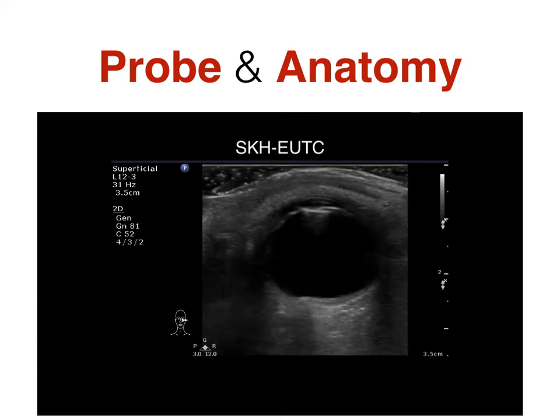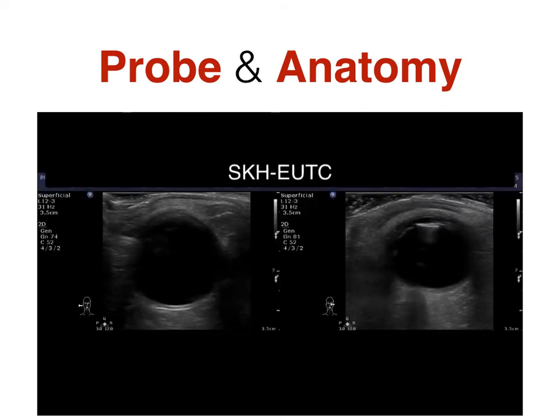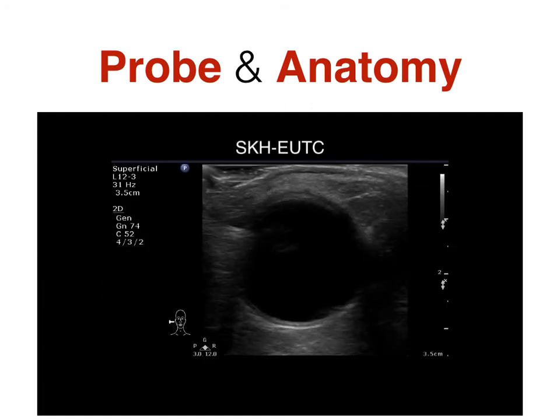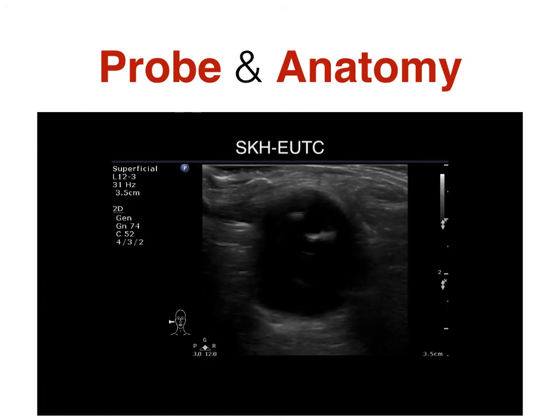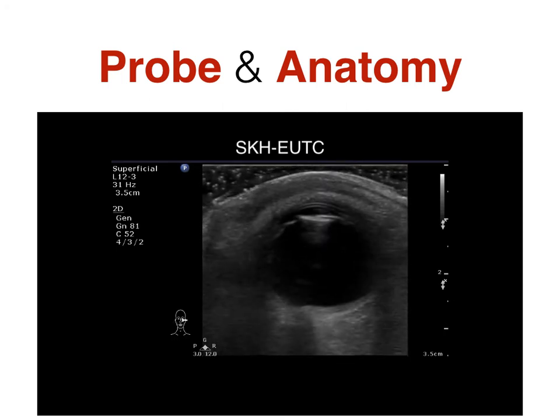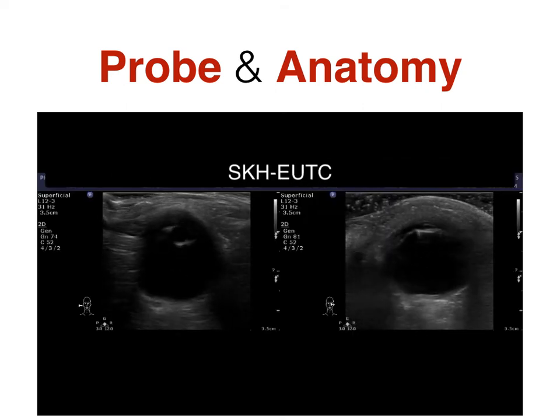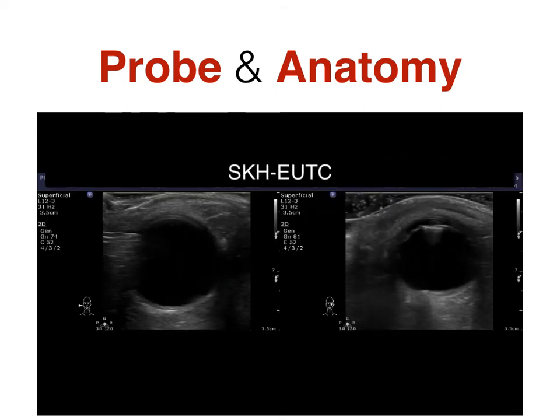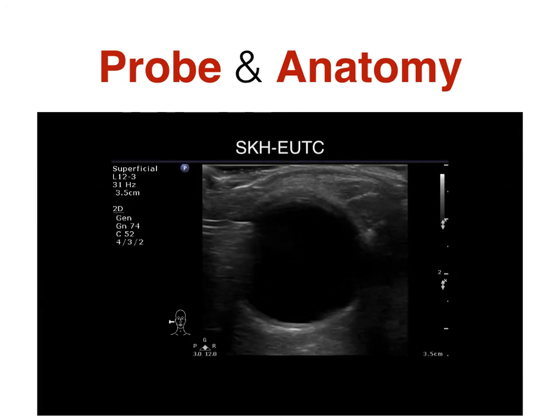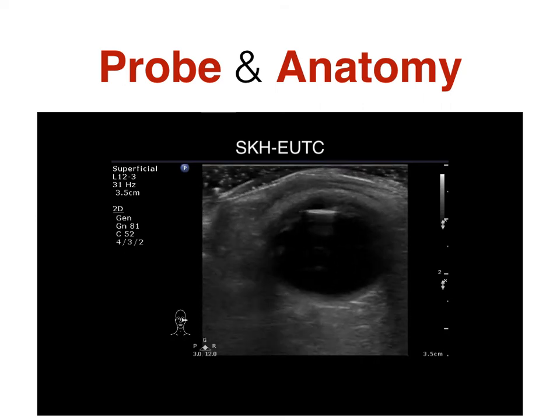Not so equal, right? So the patient's eye has some problem. Normal eye. What is the problem? The size becomes smaller, right? Irregular shape. The patient has trauma here. So it's kind of eyeball rupture. So be prepared not to compress the eyeball. Instead, use copious gel and rest your hands and the probe without touching, just to touch the gel.